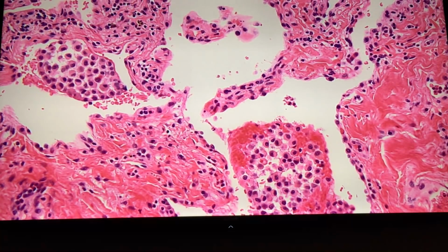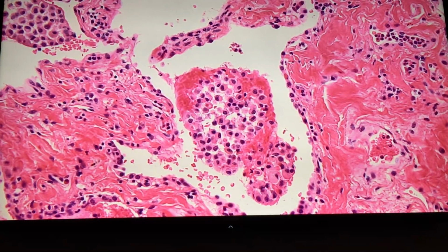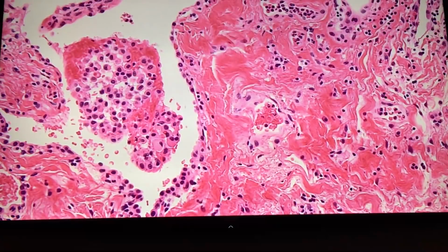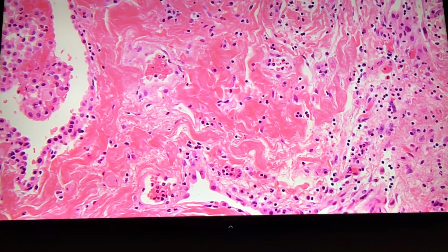How about here? Wait a second. Some acute inflammation also. Just bring this stuff to the middle. What's on the right now? Yeah, bring that to the middle. Stop. Yeah, like this. What's going on here? Some eosinophils. Yeah. How does the interstitium look?